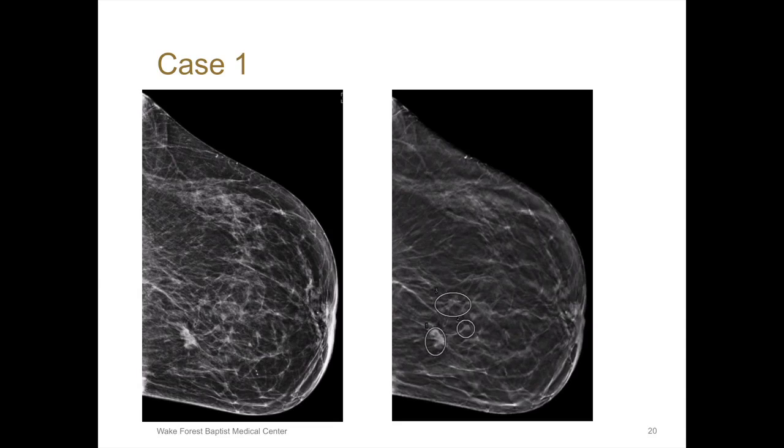So this was important. We already knew the patient had to be recalled, but now we know that there are multiple masses in the breast.